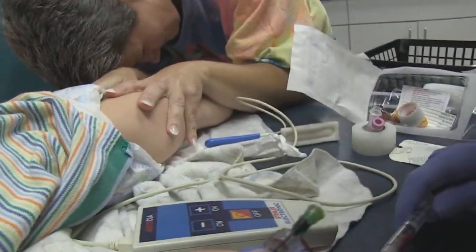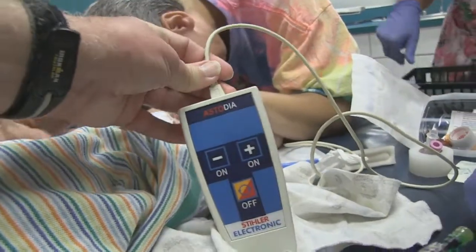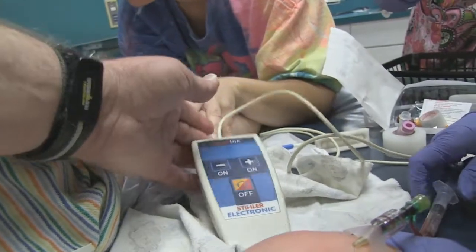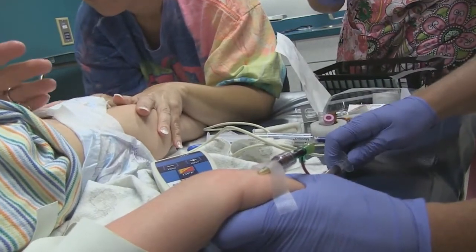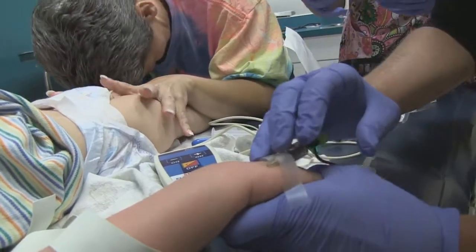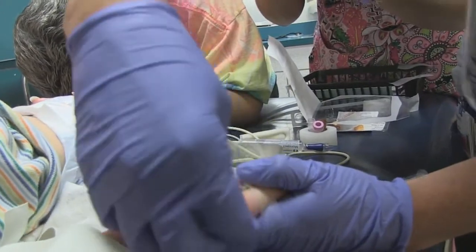You've got yourself one heck of a good vein there. This is called an Astodia — that's the product we have. We've tried a couple of them and that one's a pretty good one for a reasonable price. And it just prevented him from being stuck a hundred times. You okay with that, grandma — being stuck only once? I'm proud of her.